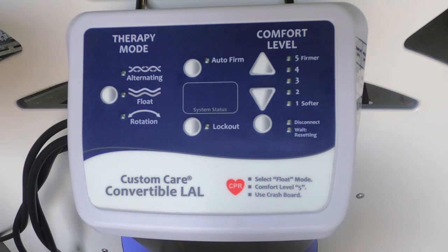This system can be used with or without the controller in place. It has a mattress component and a controller component. The controller provides airflow to the support surface and to several therapeutic modes of operation. It's important to let you know that all the systems obtained by Southern Illinois Healthcare will have a controller with them. It's dedicated to the mattress. This is of great benefit to your patients presenting with various levels of risk for soft tissue injury.